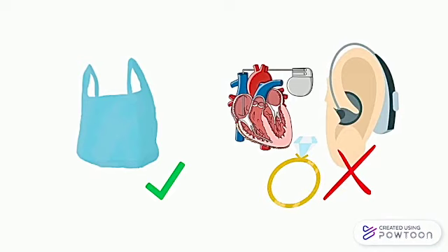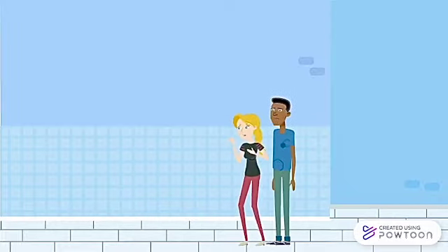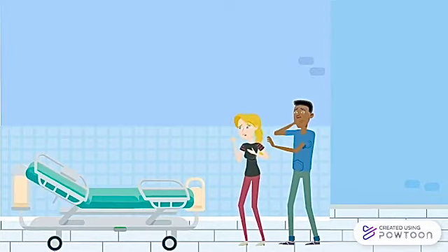Acoustic noise is generated from the MR system. While frequency is typically under the accepted range of causing damage, it is reported to cause disturbances for patients. Increasing the anxiety, temporary hearing loss, or simple annoyance creates a difficult space for patients to maintain calm and optimize imaging results.